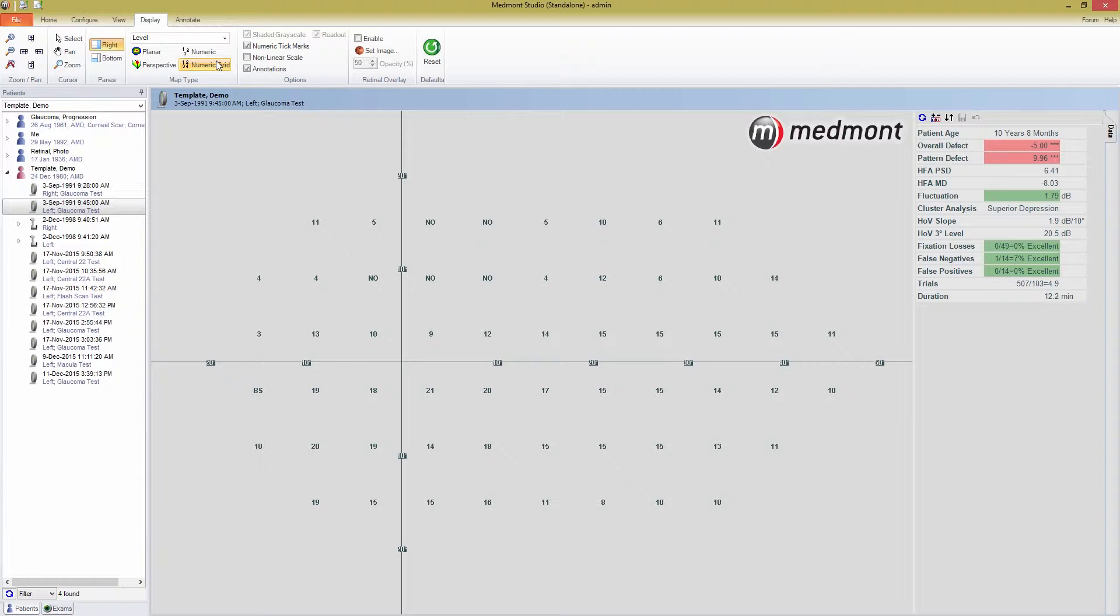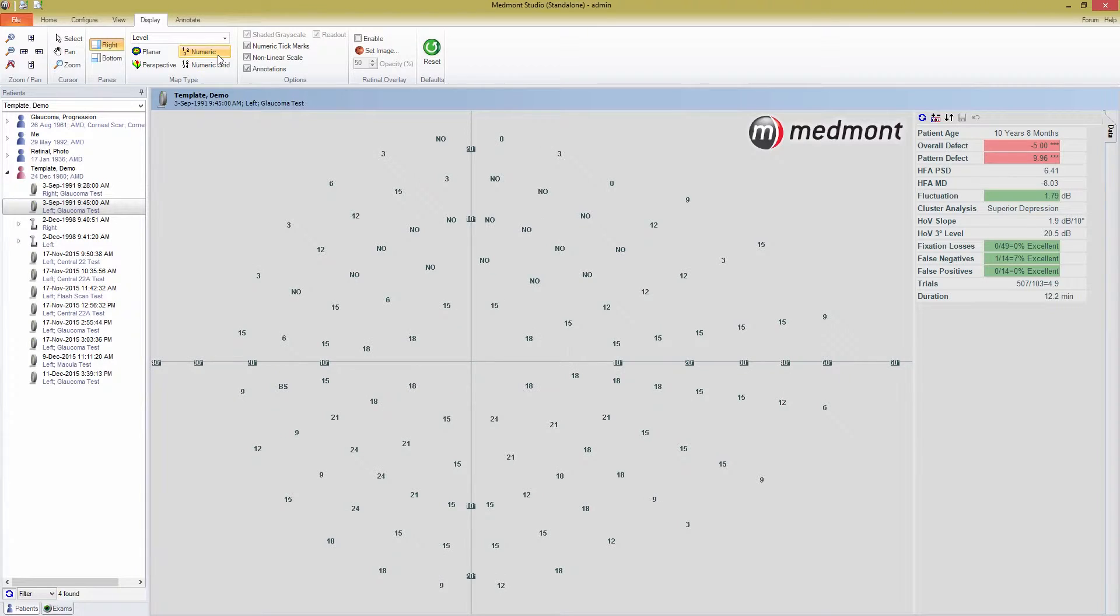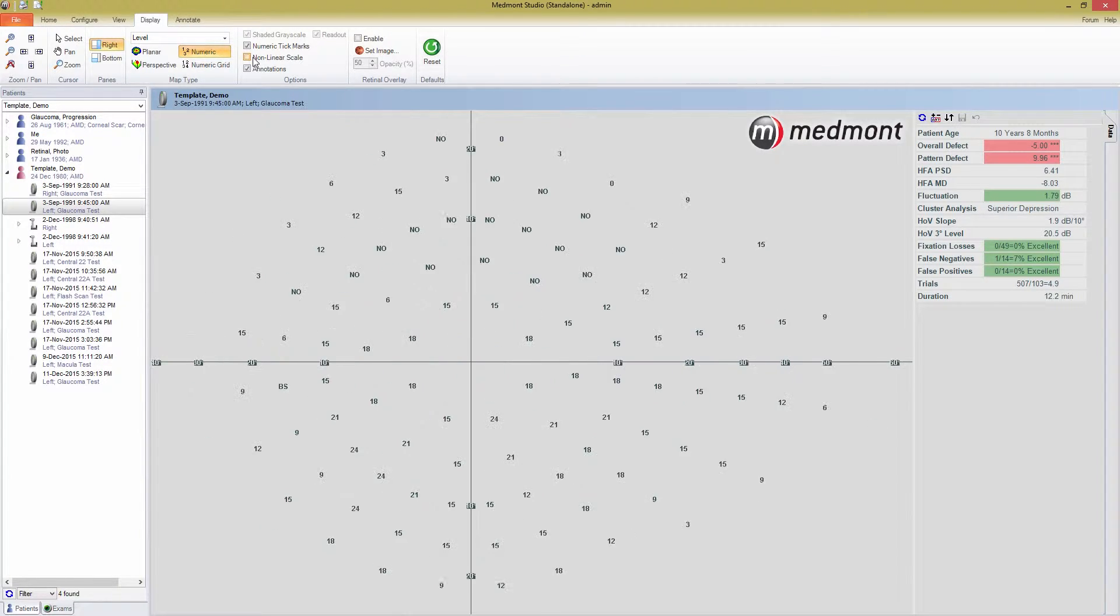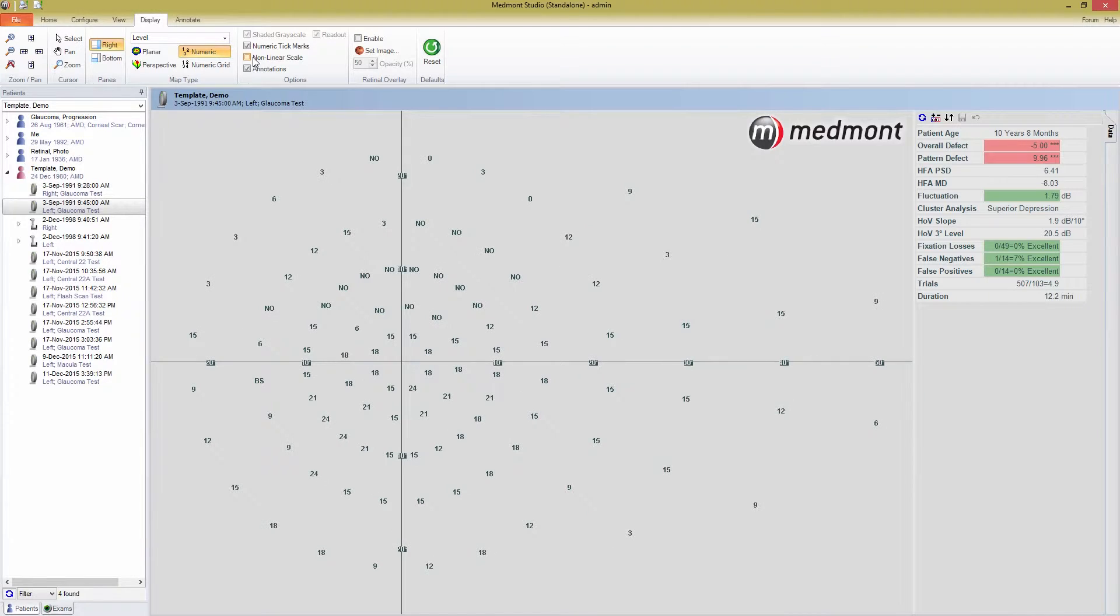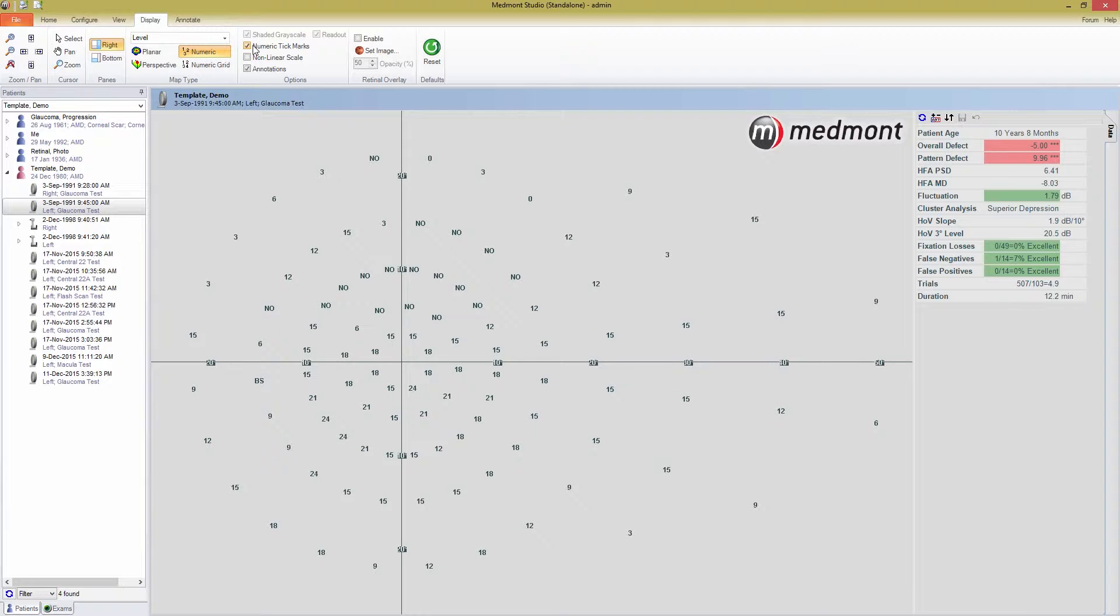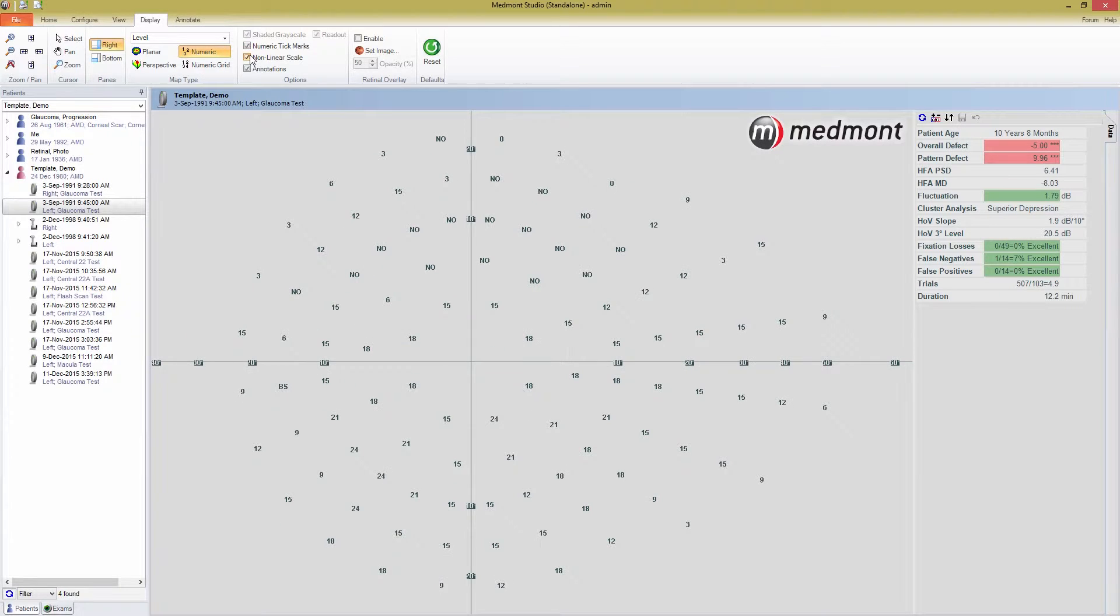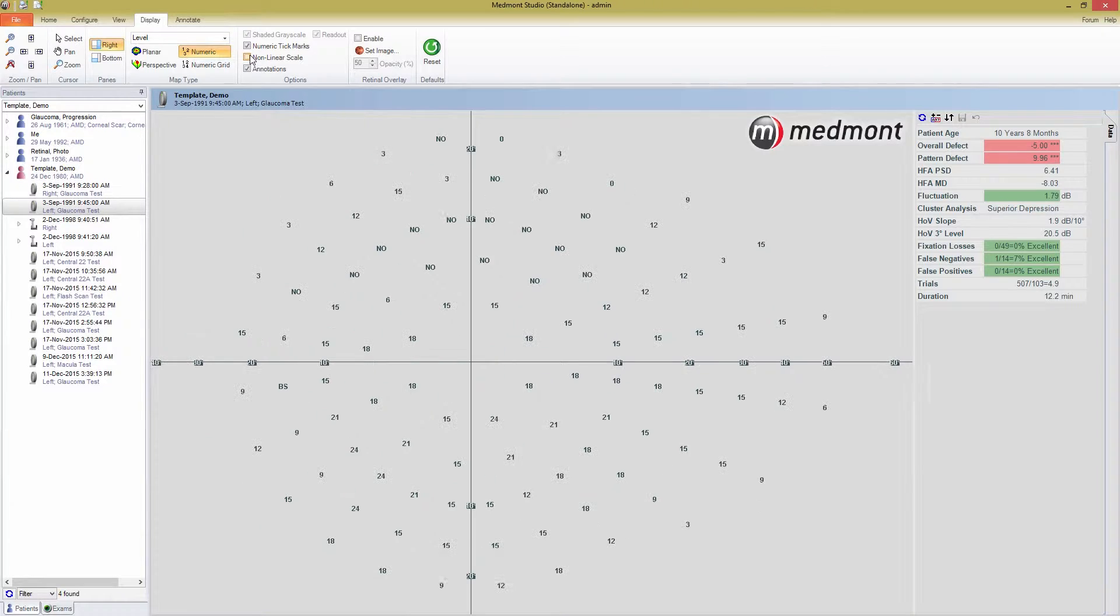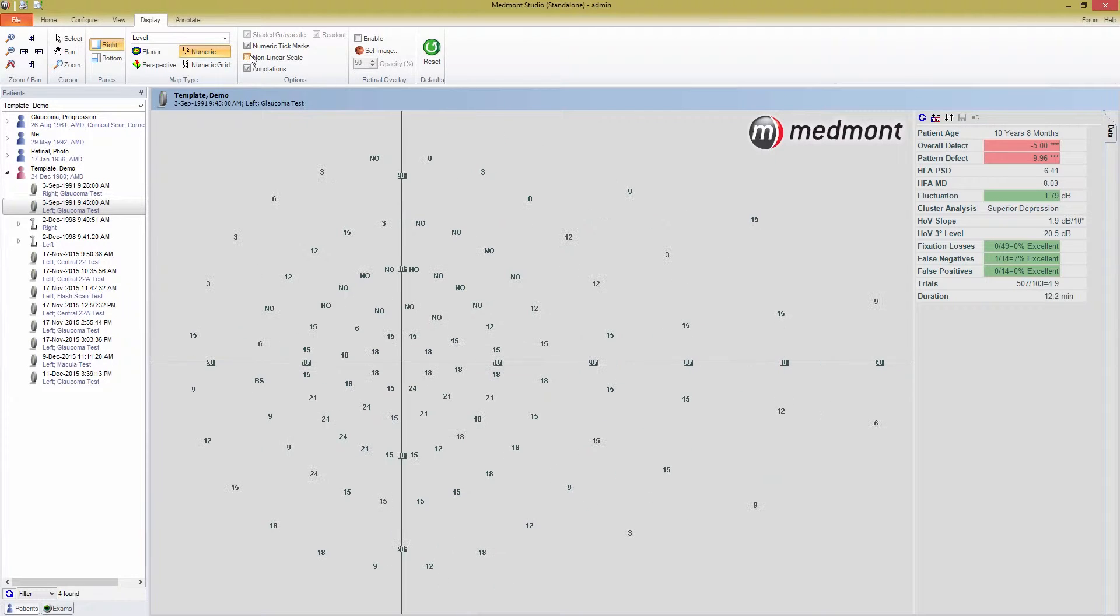Numeric data is displayed by default in a non-linear scale. This is done to spread out the high density of macular points and to make viewing easier. However, if you prefer to see your maps with linear scaling, you can toggle it on and off using the non-linear scale box in options. You can also choose to display numeric tick marks along the vertical and horizontal axis by pressing the numeric tick marks button. If we toggle between linear and non-linear scaling now, you can see that the scale adjusts with the data. Be aware that the non-linear scale option applies only to the numeric views.